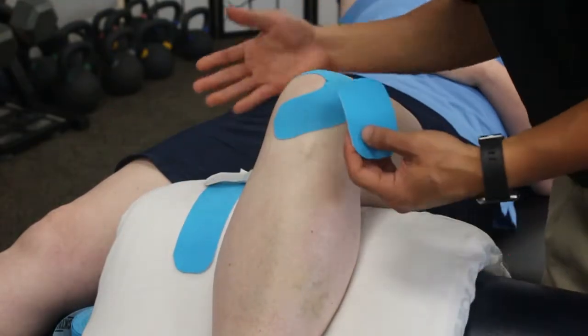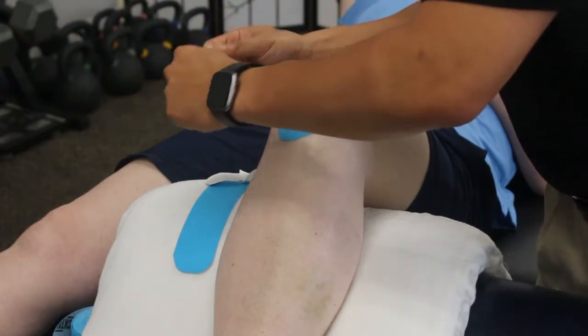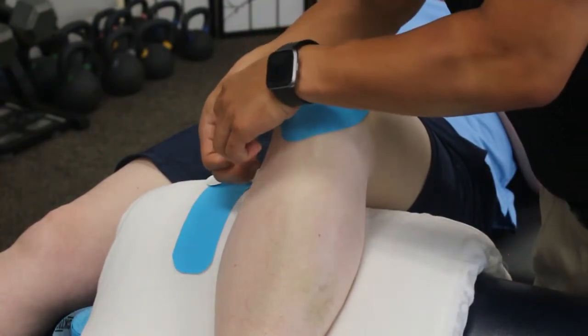The MCL runs right on the inside of the knee, so I'm going to put a bit of tape right to support that medial collateral ligament. With this tape here, I want to put it on pretty good stretch just so we support that ligament a little bit.